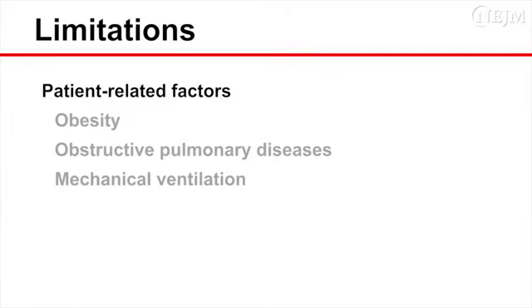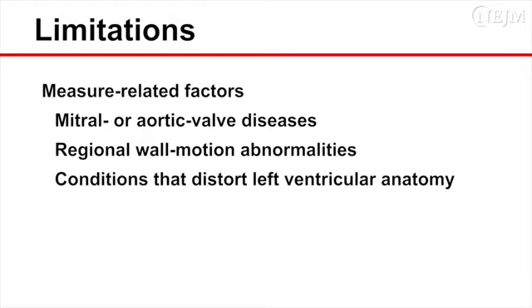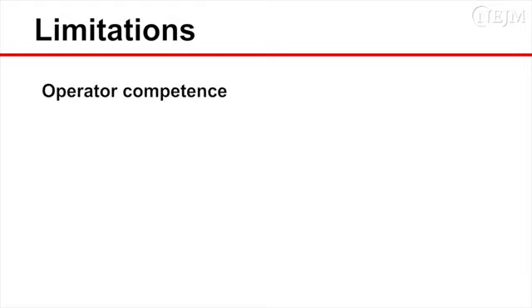Proper use of focused cardiac ultrasonography may be limited by patient-related factors such as obesity, obstructive pulmonary diseases, and mechanical ventilation. By measure-related factors such as intrinsic mitral or aortic valve diseases, regional wall motion abnormalities, and conditions that distort left ventricular anatomy, and more importantly, by operator competence.